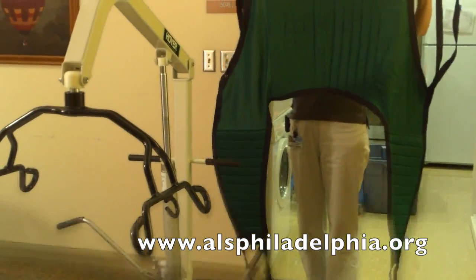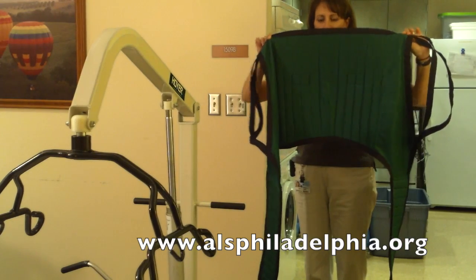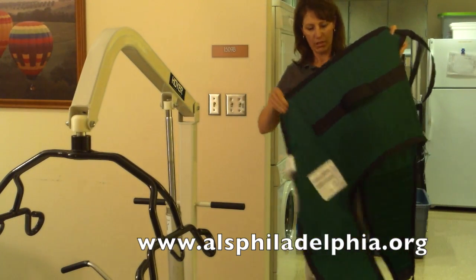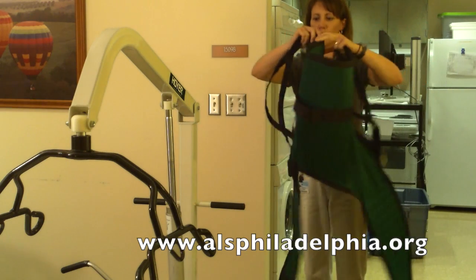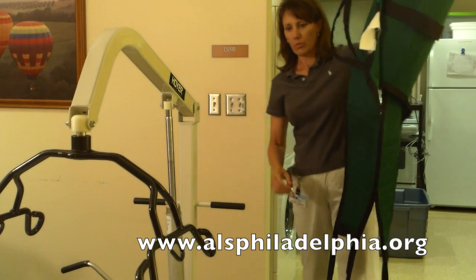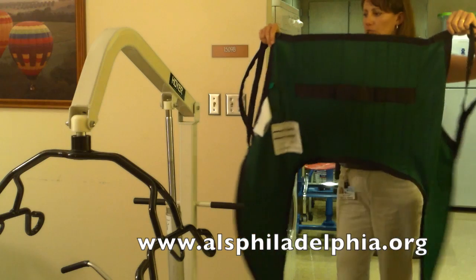This is the type of sling that you will get. It is called a U-sling. This one does not have a head support, but you will probably have a head support, and there will be a handle at the back. There will be two handles on the side, and then there will be two parts that sling around the legs.